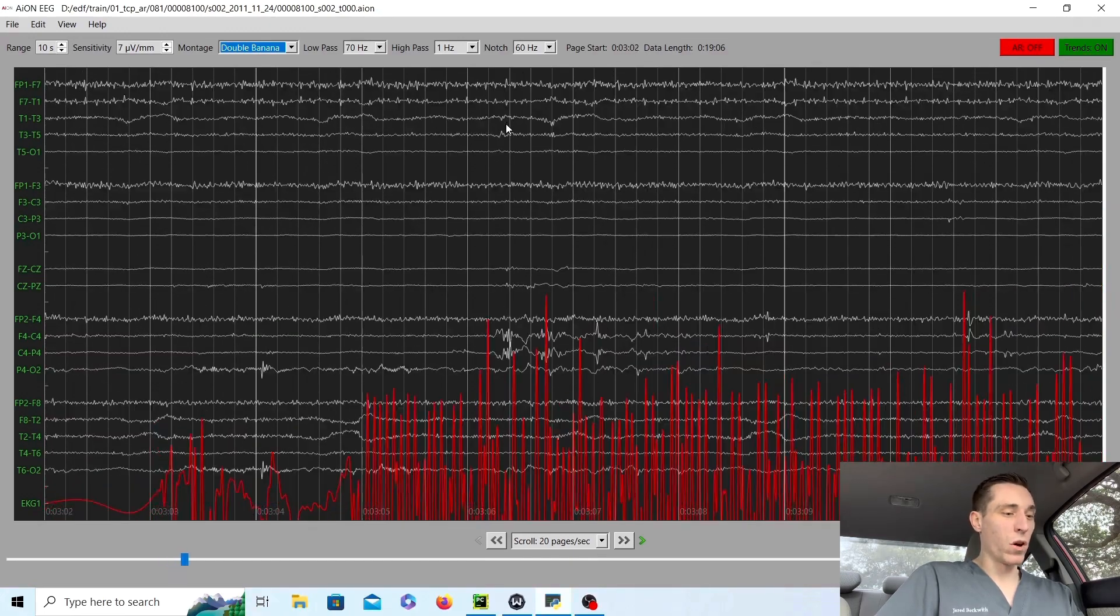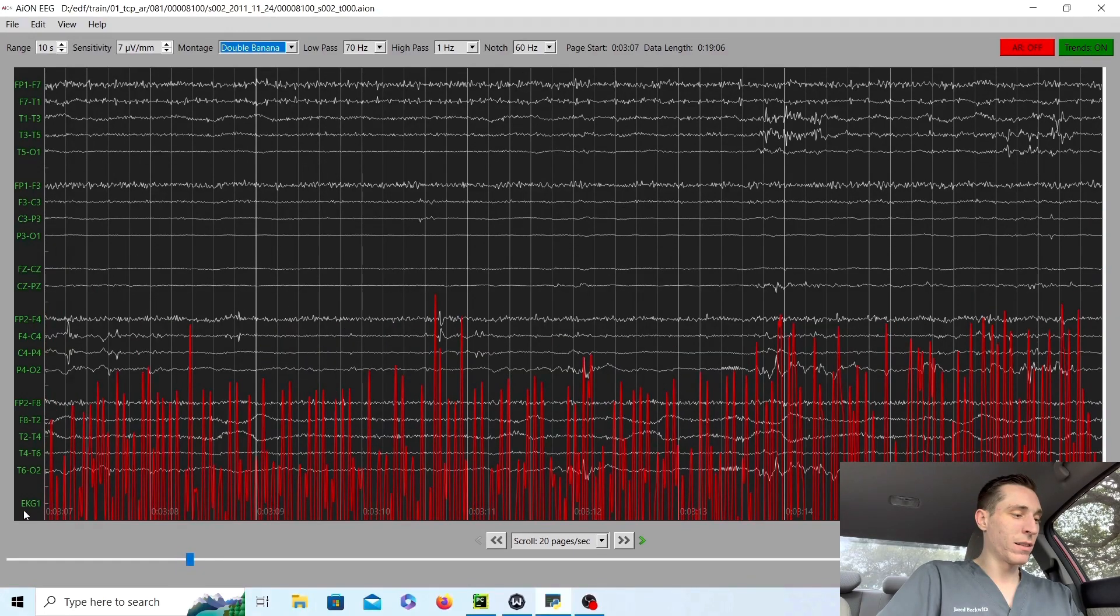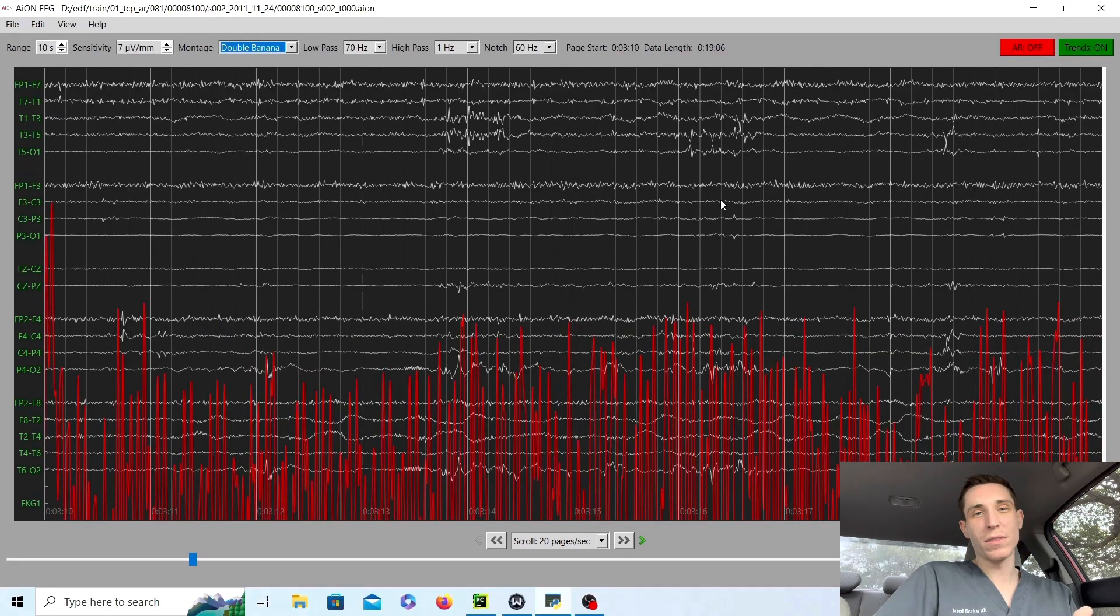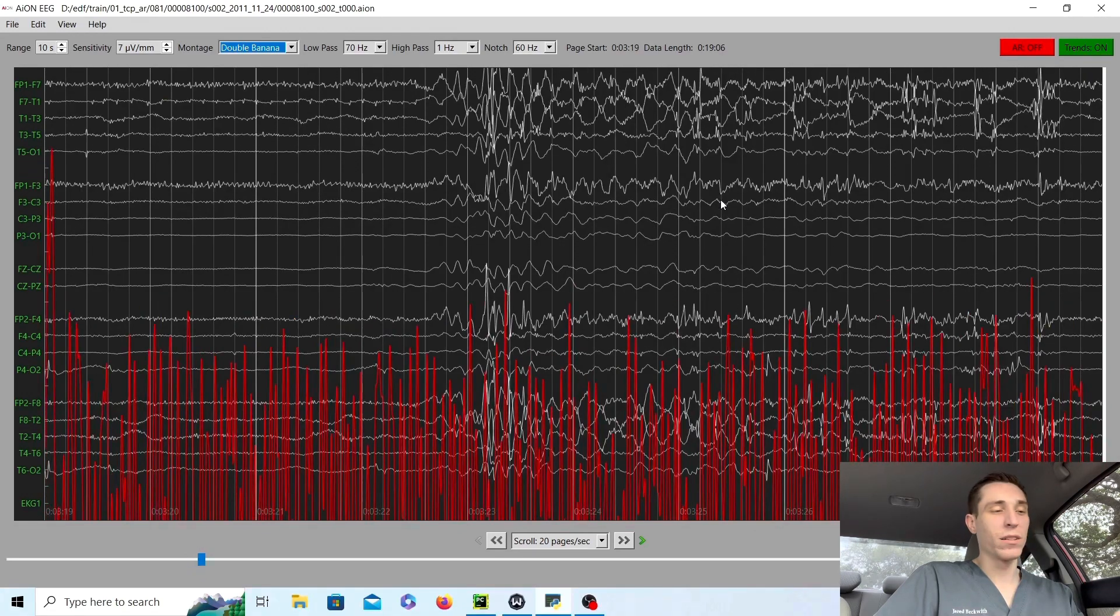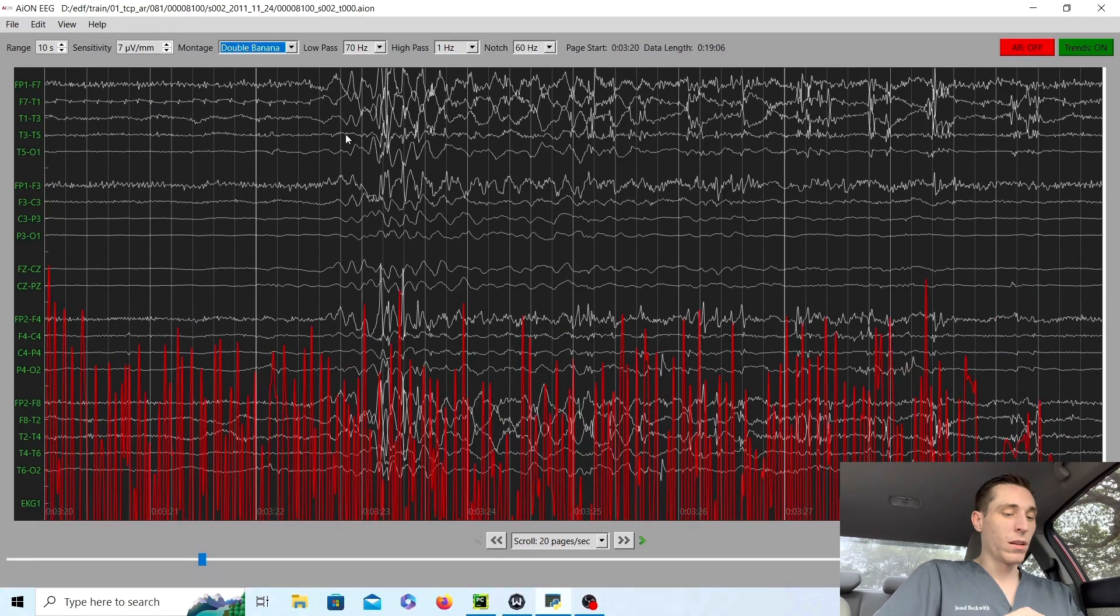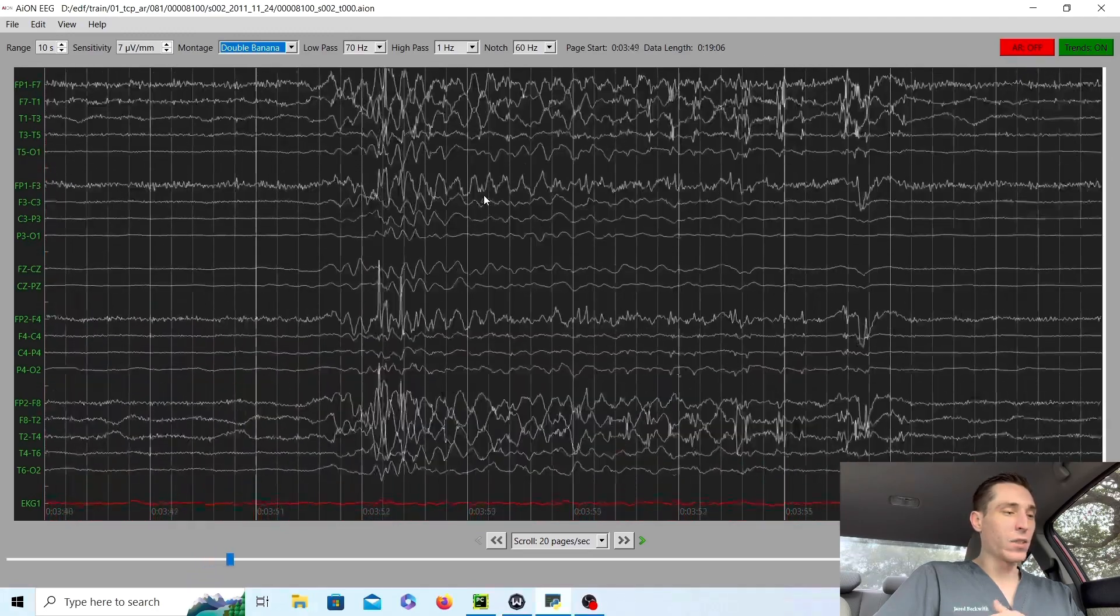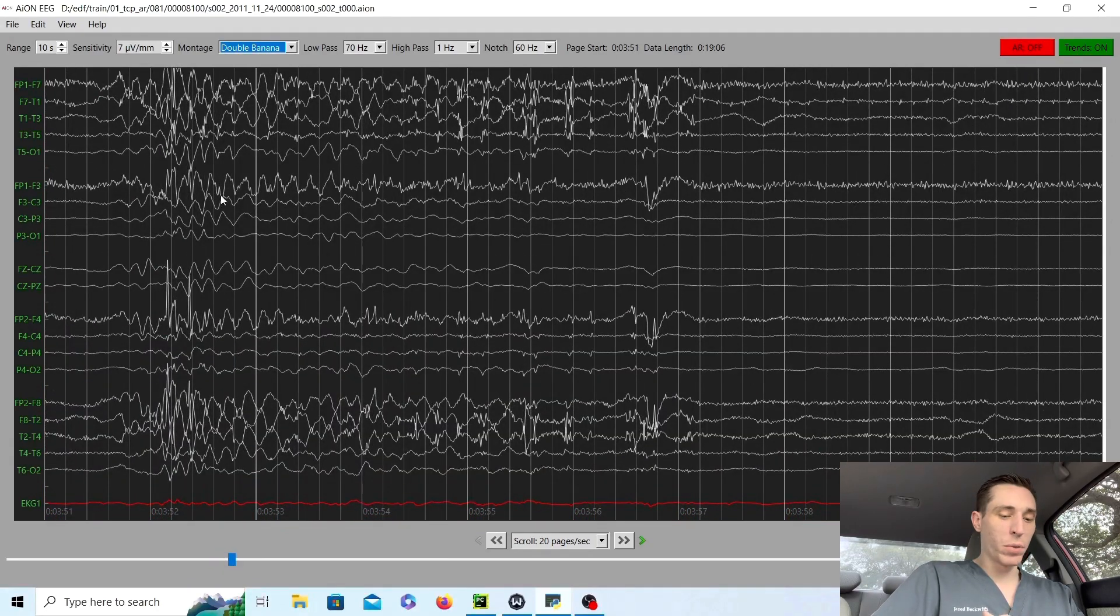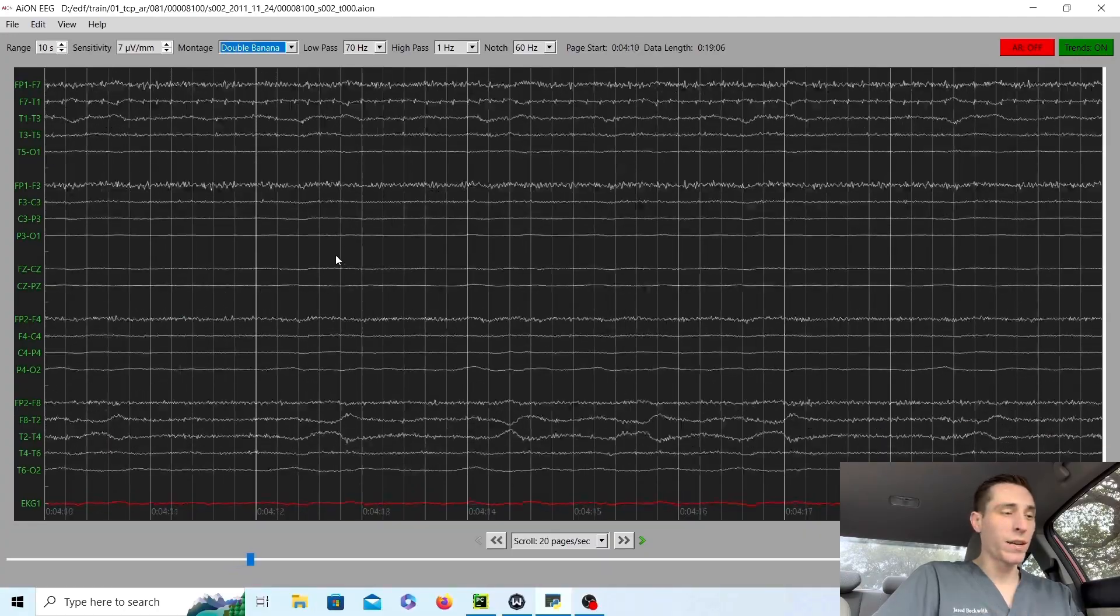Now that's something you don't want to see. This is one of the worst patterns to have, and it looks like their EKG electrode is off at this point, which happens in the ICU. A lot of tests getting done, a lot of things getting done. And if we scroll through the record, it's essentially going to be this burst suppression pattern over and over again.